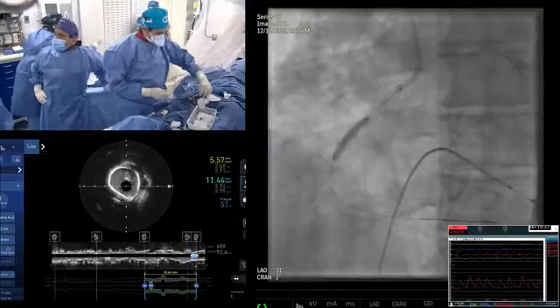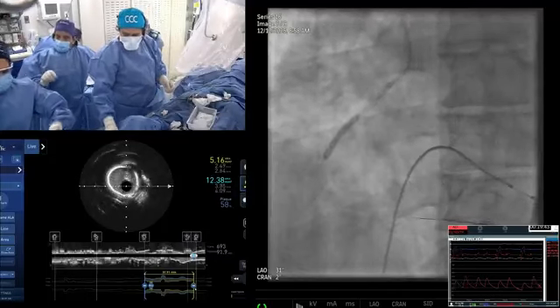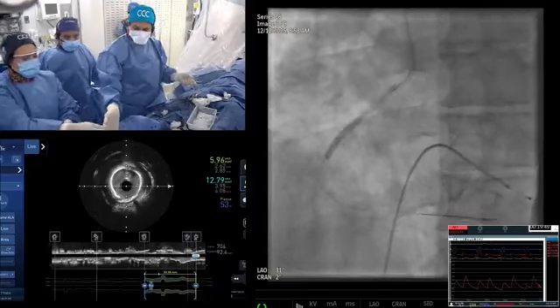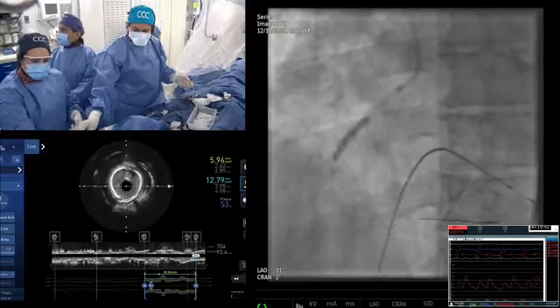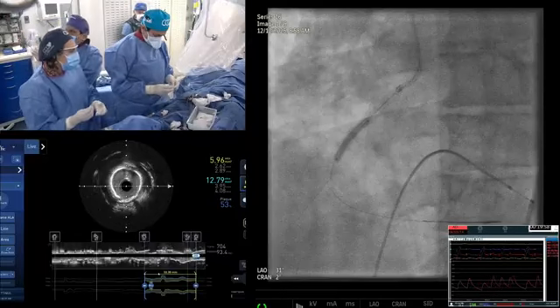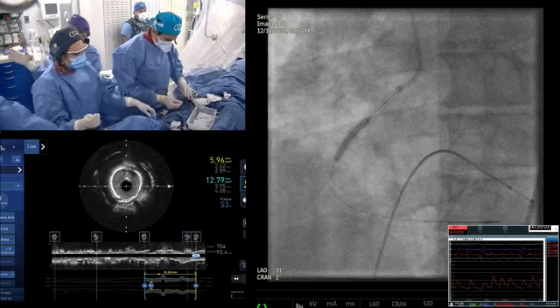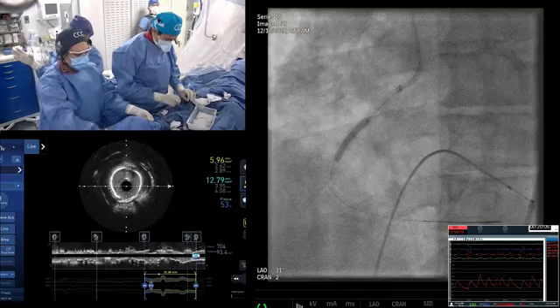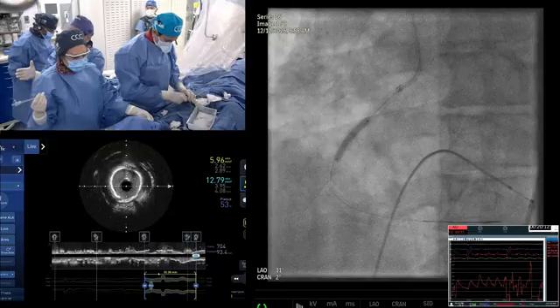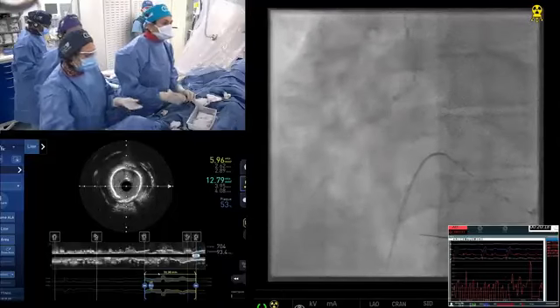That question always comes: once you're done with the rotational atherectomy, then do you do IVL or a cutting balloon? Now, we saw that the latest trial did show that using both is equal outcome after the rotational atherectomy. So there was no additional advantage of the IVL after rota. If you did not do rotational atherectomy, then IVL gave you a better lumen, more cuts and better MSA. But if you have done rotational atherectomy, in the randomized trial of Shortcut, both IVL and cutting balloon gave similar lumen, similar fractures.